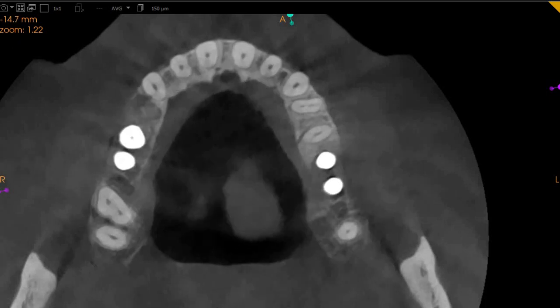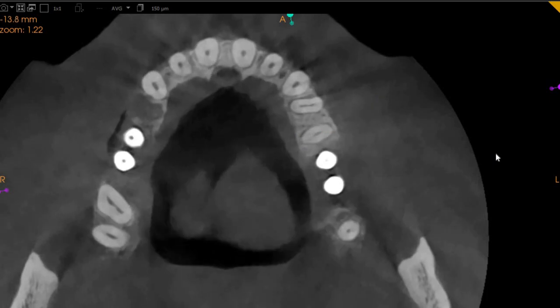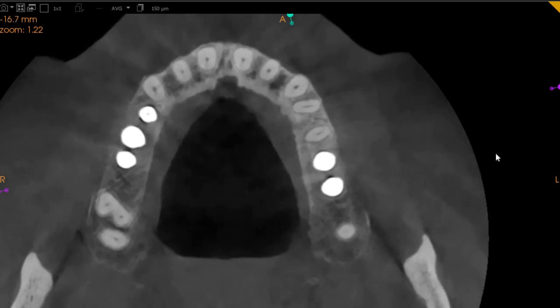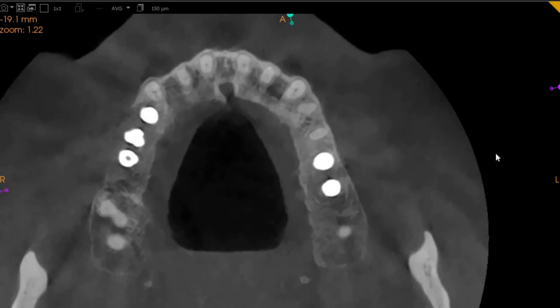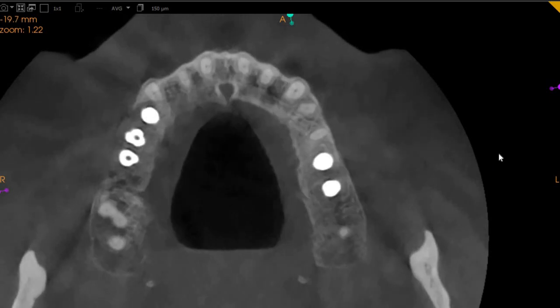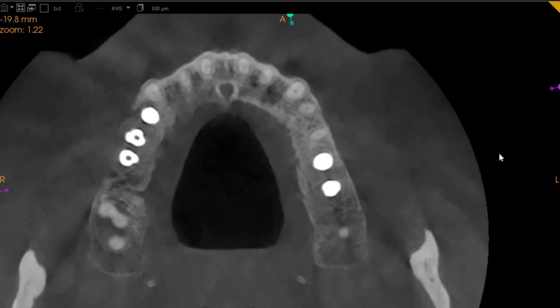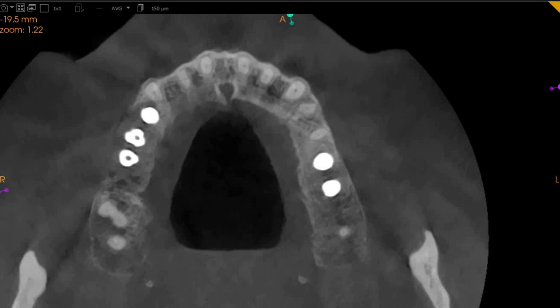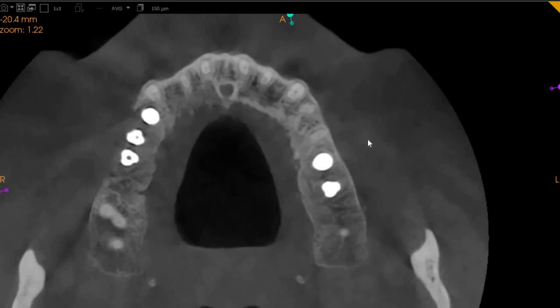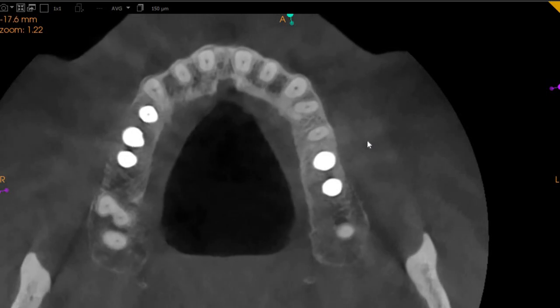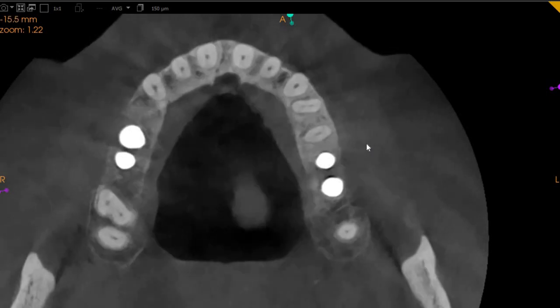The upper left five shows a crack situation associated with this tooth — one on the bilateral aspect and one on the mesial aspect. Moving more inferiorly towards the apex, we can actually see that this tooth has PDL widening as well as a crack that extends all the way into the bone here.